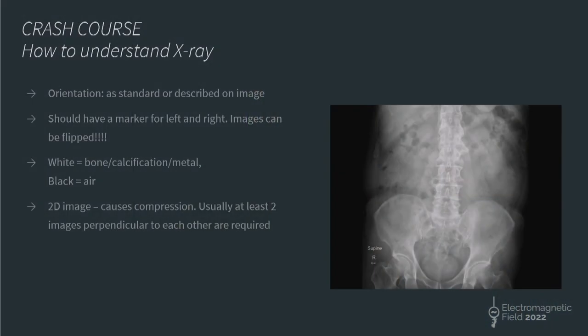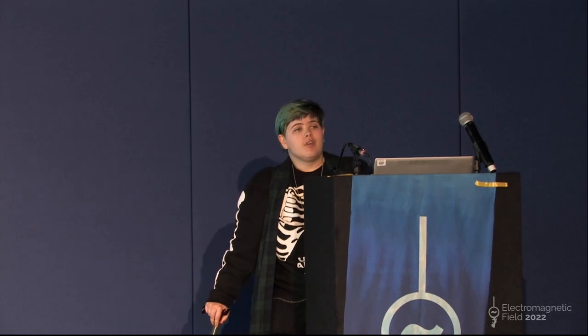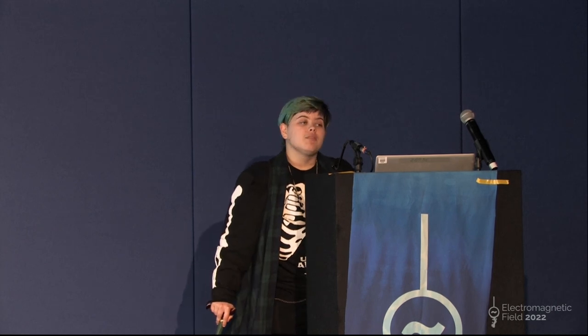In general, I can't tell you how to look at an X-ray and know how everything is supposed to look and how you're supposed to read them in a 30-minute talk. What I can say is, for modern X-rays, if it's white, it's bone. If it's black, it's air. Everything else is somewhere in between. And it's compressed. You are not a 2D image. You are 3D, you have gubbins inside, and those gubbins will overlay. Sometimes you will look at a picture and go, oh my God, and then it turns out it's a roll of fat that has created a darker line, and it's not actually a break or anything.